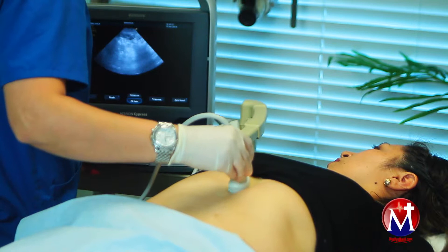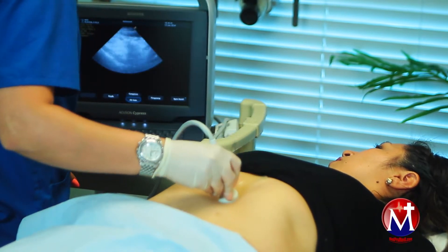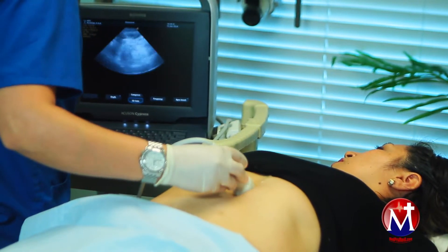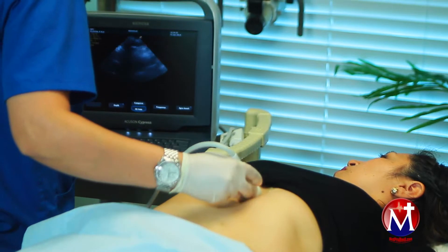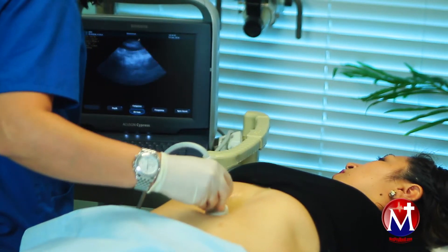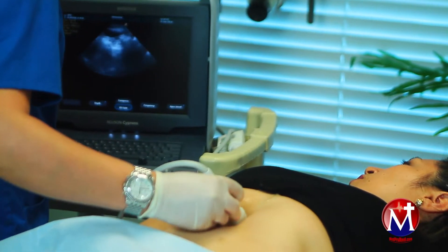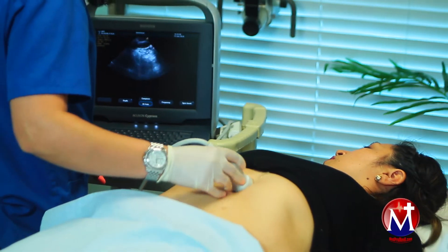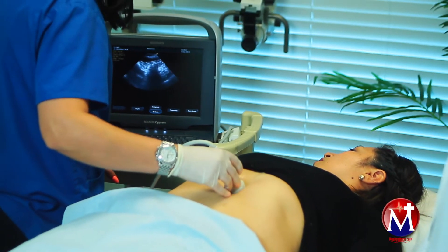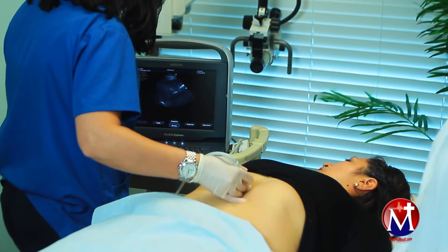Layla is doing an ultrasound abdominal exam on this patient who presented to her doctor with right upper quadrant pain. As you can see, the test is painless — the patient is comfortable and we are able to see the images as Layla is actually scanning.